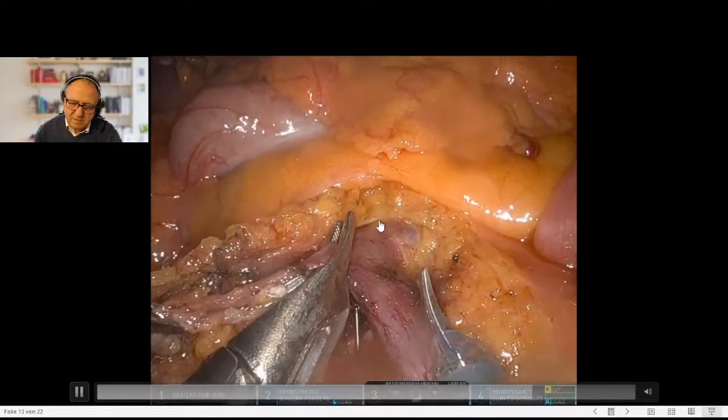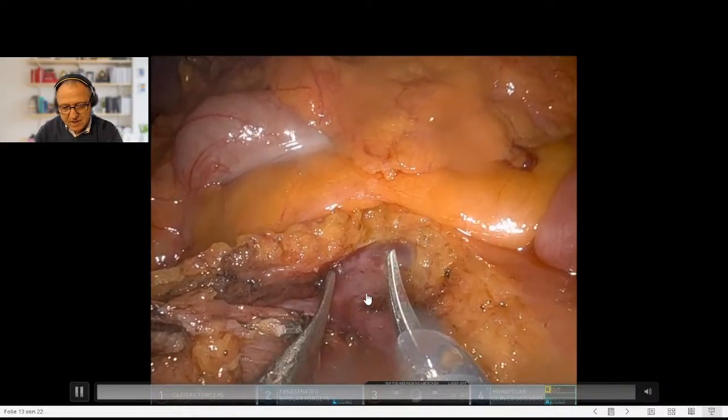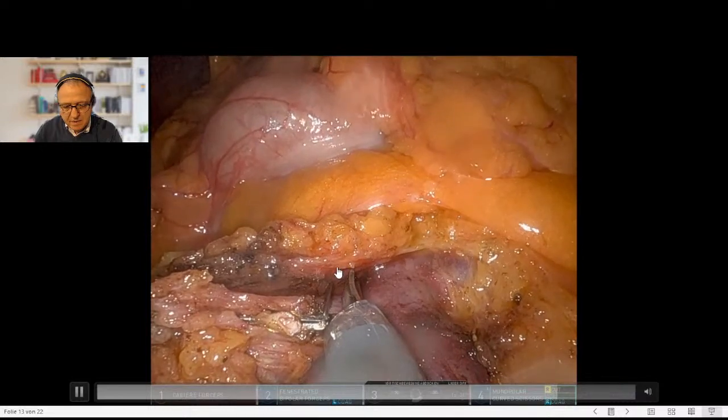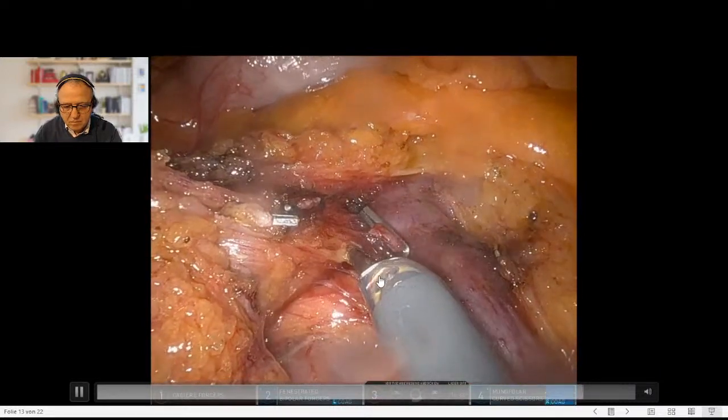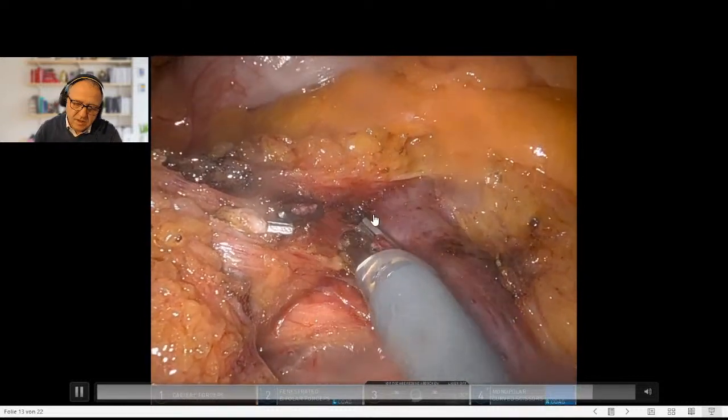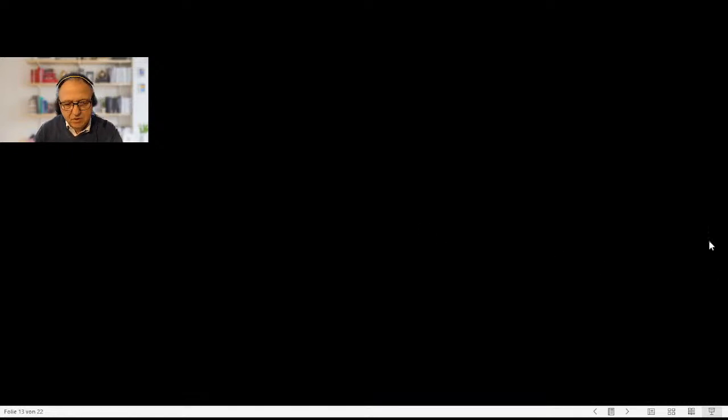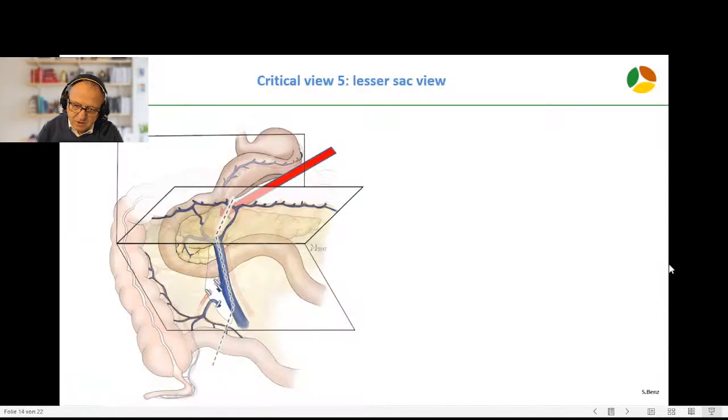Same thing with the vein. But if you use these metal clips, you really have to make sure you see the distal end of both ends of the clips. Then you dissect your way further up, but you stop usually a centimeter or so above the iliocolic. You don't push to dissect the body of the pancreas.